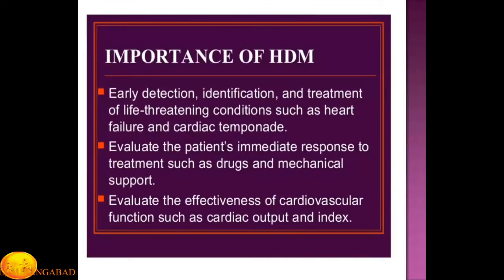Now, as I just told you, the importance of hemodynamic monitoring lies in diagnosing whether the heart is really not functioning properly, or we have to give many drugs. We have to see the response to the drug by doing this hemodynamic monitoring, and then we can plan the treatment of the patient accordingly. We will know whether the patient is improving or deteriorating, and then we have to change the drug, etc.